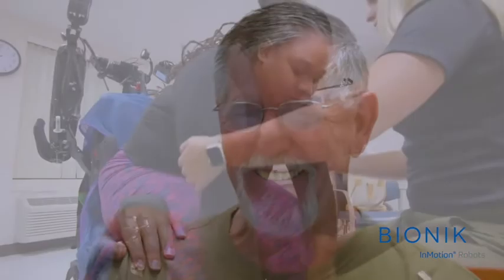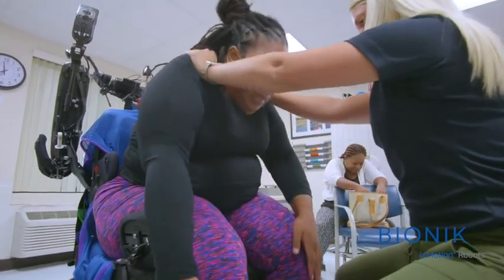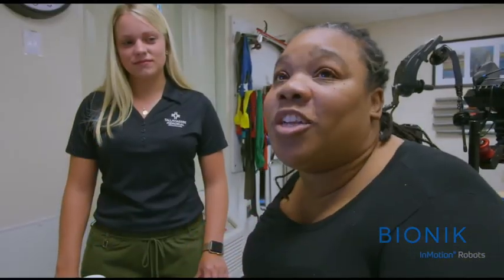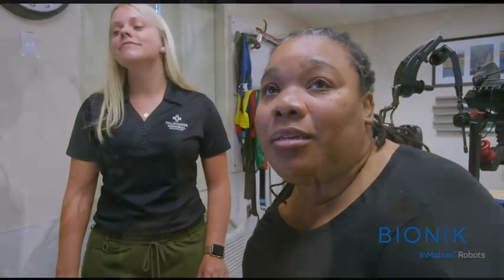Our patients realize fantastic outcomes through this clinic. And what I'm seeing in our patients is hope. They told me I would never move anything, not even my neck. And as you can see, I'm moving my neck, I'm moving my hand, I can shrug my shoulders. So I mean, this machine is just giving me hope, basically.